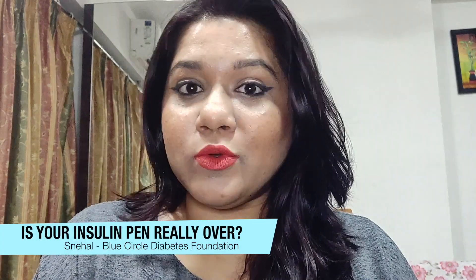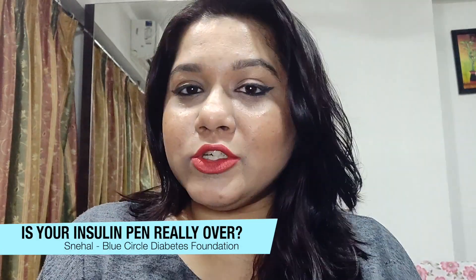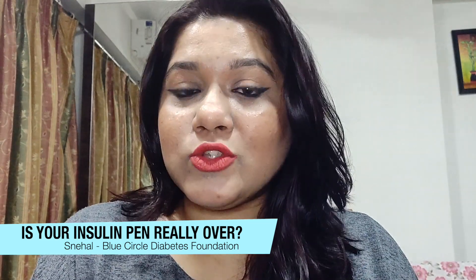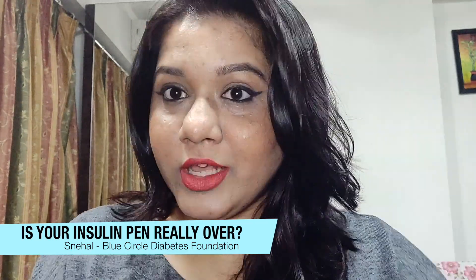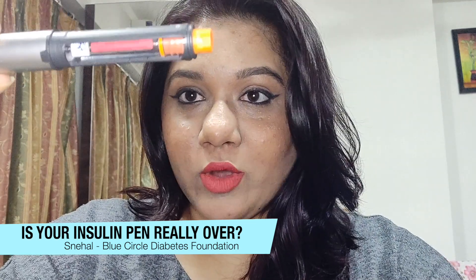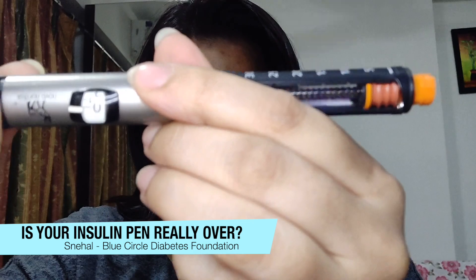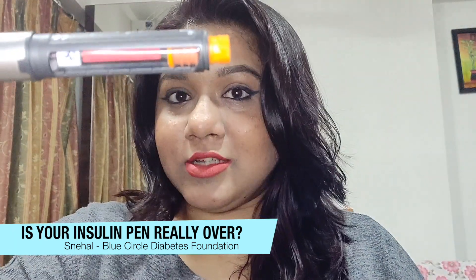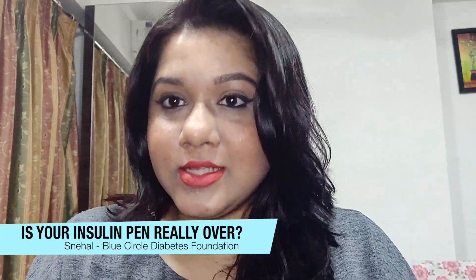Hi guys, this is Snehal from Blue Circle Diabetes Foundation, and we are back with another video. I'm going to share with you a trick that I use to get the maximum usage from my insulin cartridge. For today's video I'm going to use a NovoRapid pen. The pen is apparently empty — I cannot scroll it any further — but even though the cartridge looks empty, there's still some insulin left inside. Let's check that out.